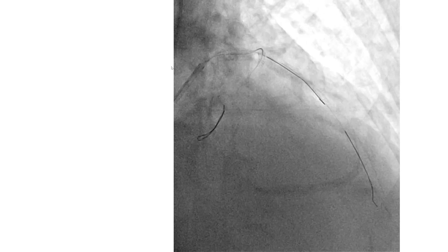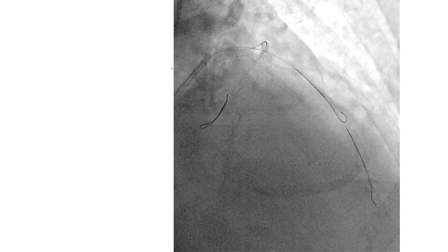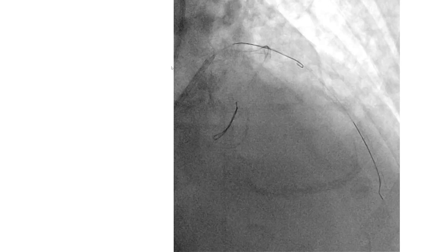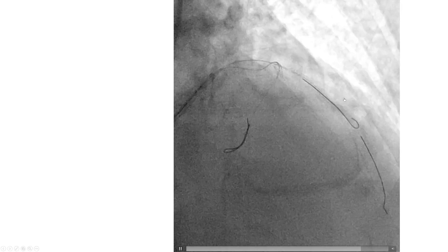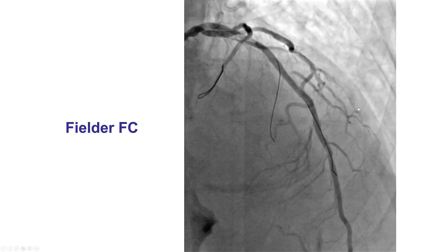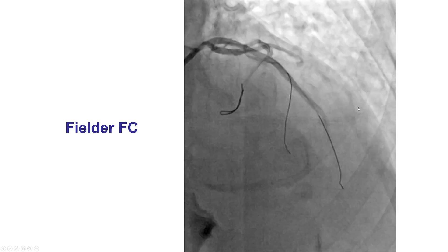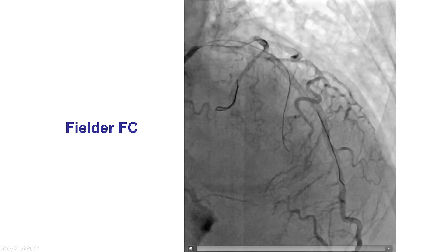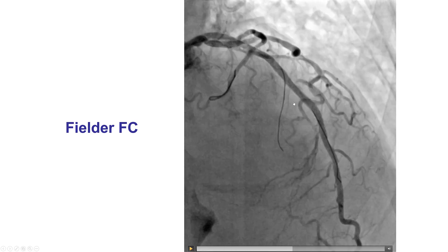As a result, we decided to treat that septal branch. We used a Fielder FC guide wire. We looped it through the previously placed stent and then brought it back, and using the diagonal branch as a landmark, we were able to wire into the septal without too much difficulty.